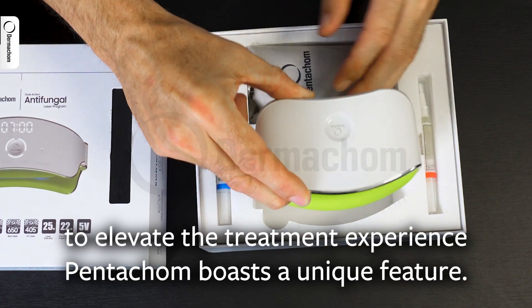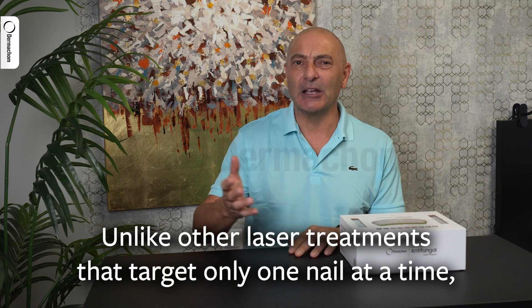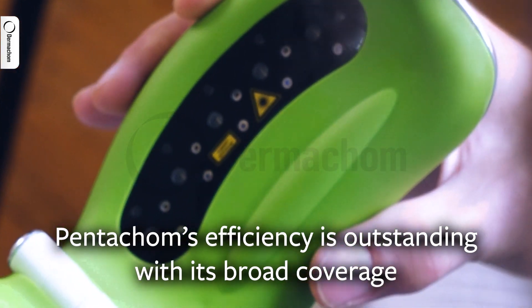To elevate the treatment experience, Pentachom boasts a unique feature: it covers all five toes simultaneously. Unlike other laser treatments that target only one nail at a time, Pentachom's efficiency is outstanding with its broad coverage.